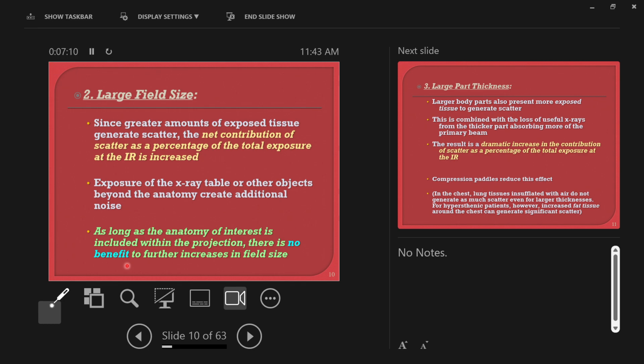So let me give you what this will come out to. What's the typical SID? We have 40 inches and we have 72 inches. Those are the two typical SIDs. So 40 times 0.02. I know it, but let me just do it on the phone real quick, to make sure I don't screw something up. 40 times 0.02 is 0.8 inches. So at a 40-inch SID, this can be misaligned as much as 0.8 inches, roughly 3/4 of an inch.